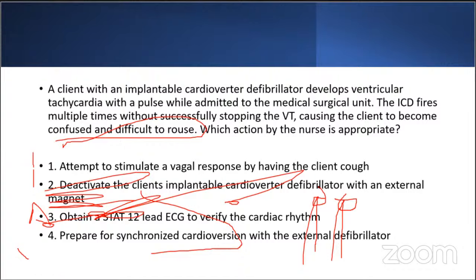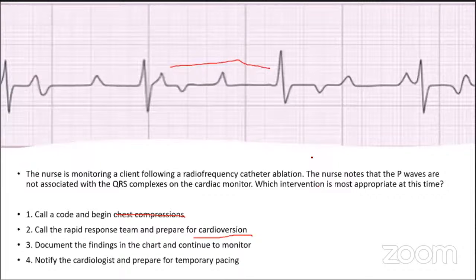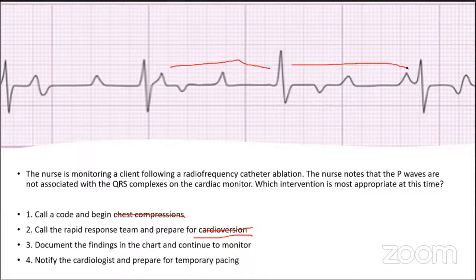So if the patient is in cardiac arrest, one way I used to remember this is: if he is in VFib, you defib. VFib means ventricular fibrillation, and defib means defibrillation. So if the client is in ventricular fibrillation, you carry out defibrillation. For unstable VTach with a pulse, we want to carry out synchronized cardioversion. So number two would be wrong. We won't carry out synchronized cardioversion for a slow, bradycardic rhythm. We carry it out for an unstable tachycardia.